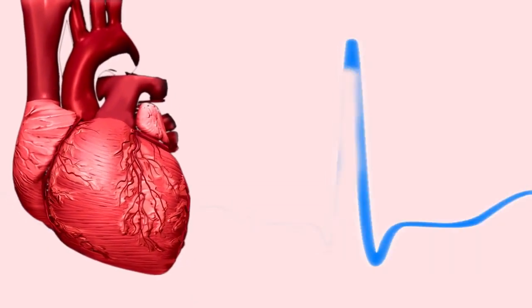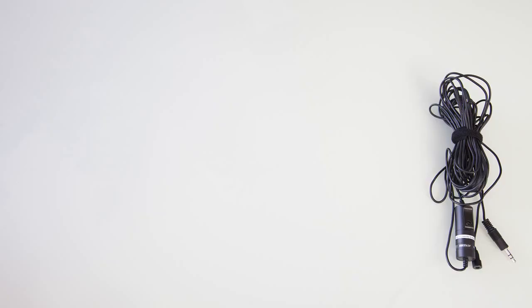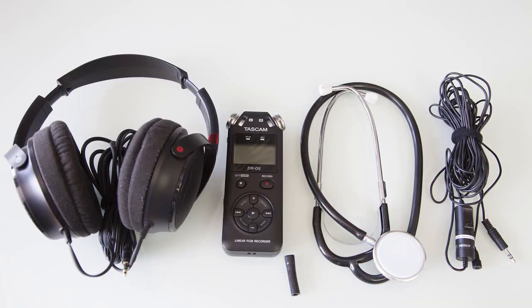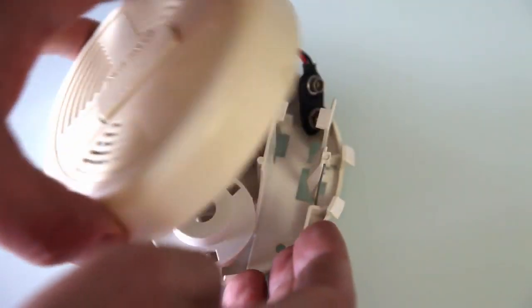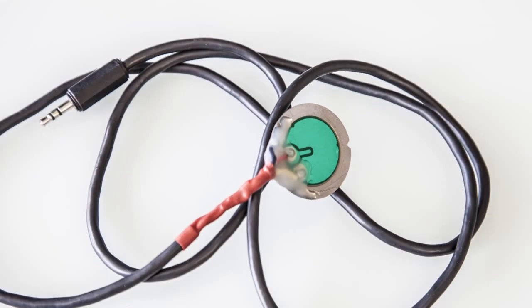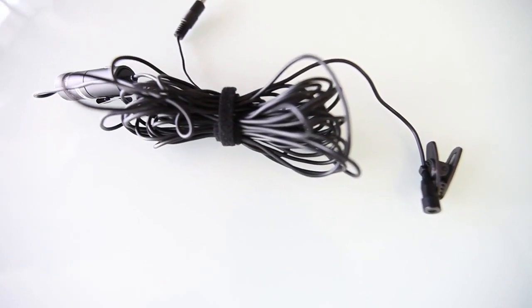Recording heart sounds is relatively easy. You will need a good microphone capable of recording low frequencies, an inexpensive stethoscope, a recording device and headphones. It is also possible to use a piezoelectric buzzer or transducer as a contact microphone. I took it from an old smoke detector. The stethoscope is not necessary if you will use the contact microphone.